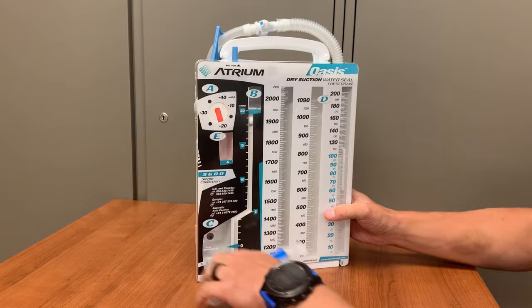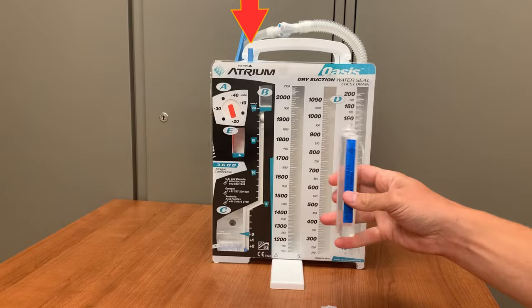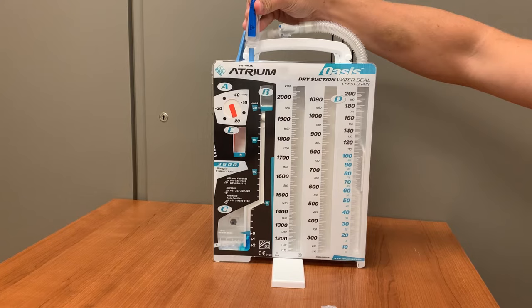Spin the stand, which is attached to the base of the unit, out to stabilize the container. It's important that this container never get knocked over or tipped. Insert the sterile water into the blue port on the top of the Oasis. Empty all the sterile water into the Oasis. There is a blue dye in the chamber that will color this water.